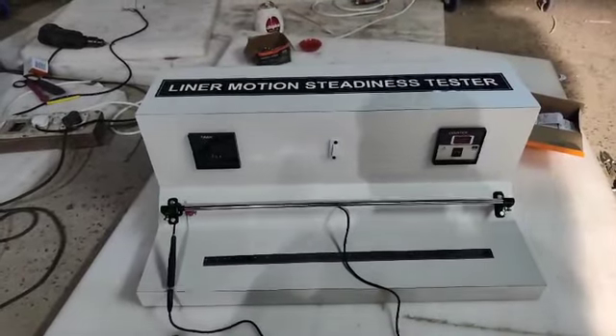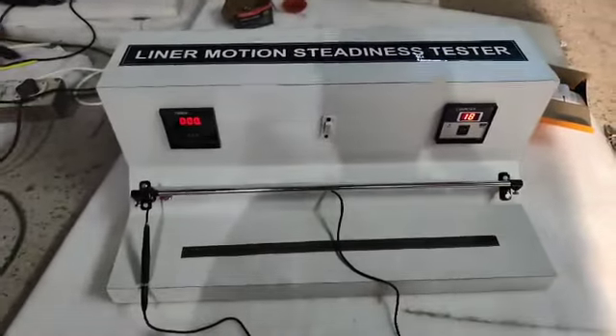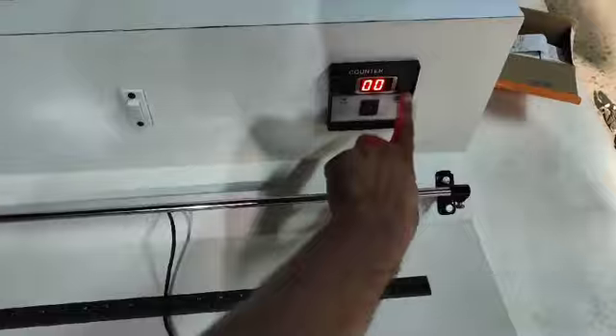Biotronics linear motion steadiness tester. I'm telling you how to operate it: just switch on the machine, select the timer. These are the number of counts and you can reset it to zero.